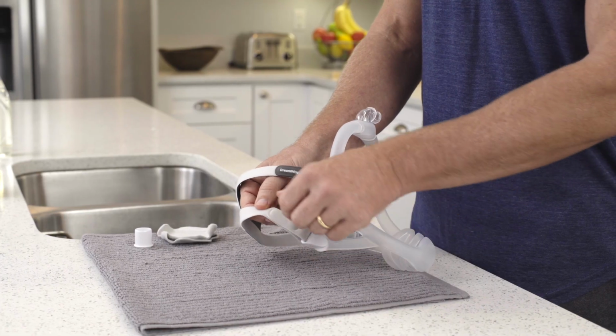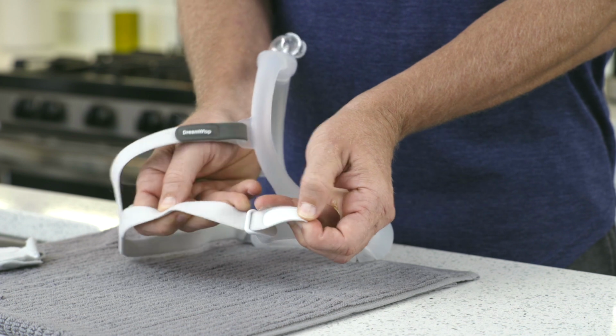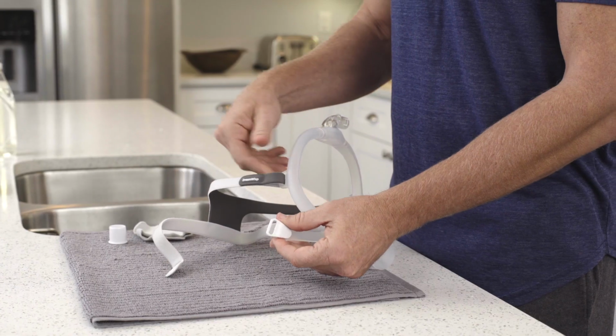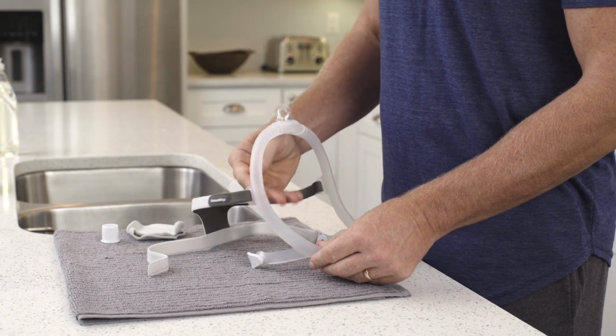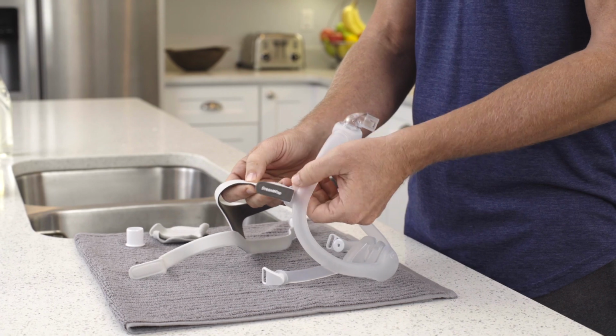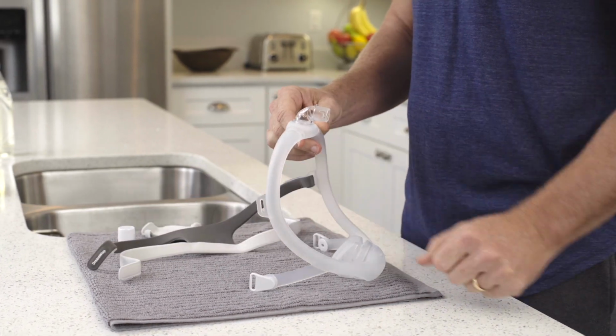Peel back the tabs on the bottom headgear strap and pull the strap through the slots in the magnetic clips. Unless you're replacing them, leave the magnetic clips attached to the frame. Undo the tabs on the top strap and disconnect the strap from the frame.